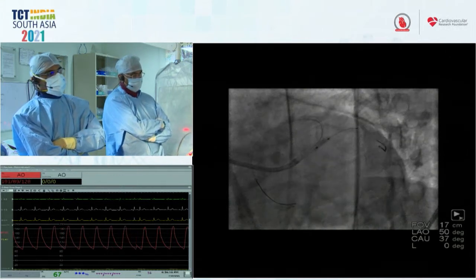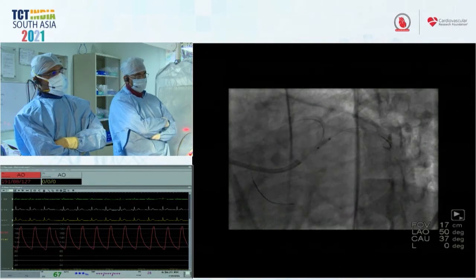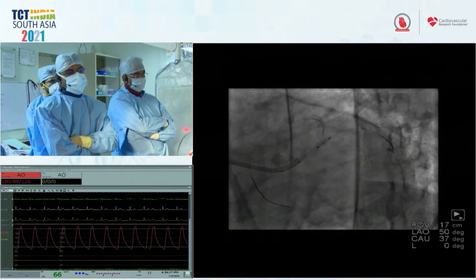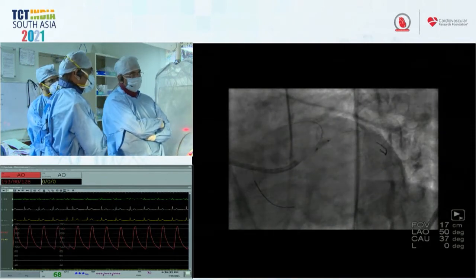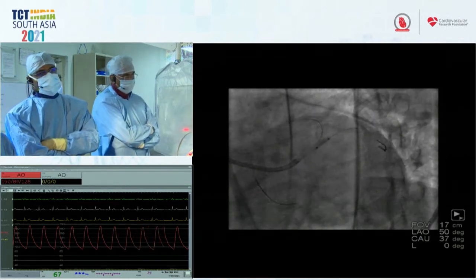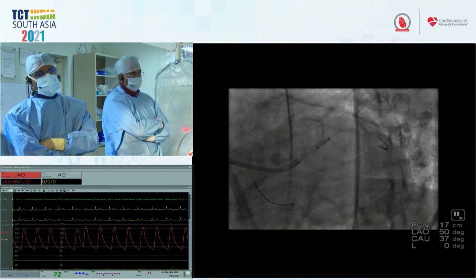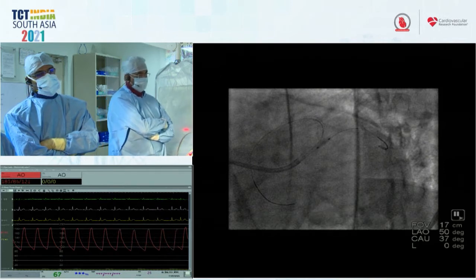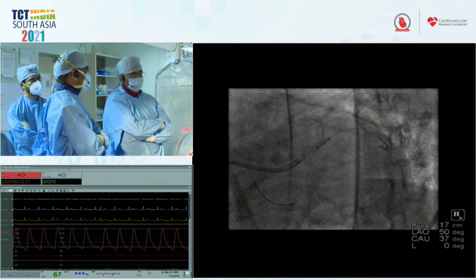With the ostial disease, I'd be looking with this balloon to see a couple of things. I probably would do this case radially, in which case the guide and the stent move with respiration a lot. So you have to be mindful of placement there, Ziad, because you don't want to miss on either side of it. Angiographically I would love to be able to do that, but whether it's feasible I don't know, because there's a lot of motion. I would mark the ostium, as you suggested, then come in with a balloon and shoot the system stable enough that it's not going to move while I'm trying to place a stent. With a couple of millimeters of margin on either side, it's going to be tough to pull off, but that would be favorable.